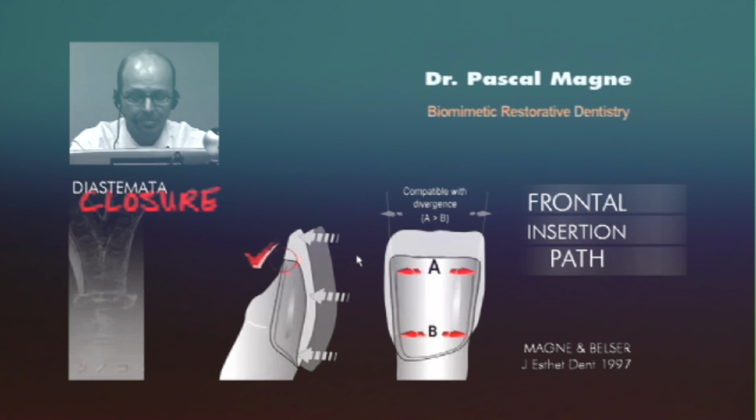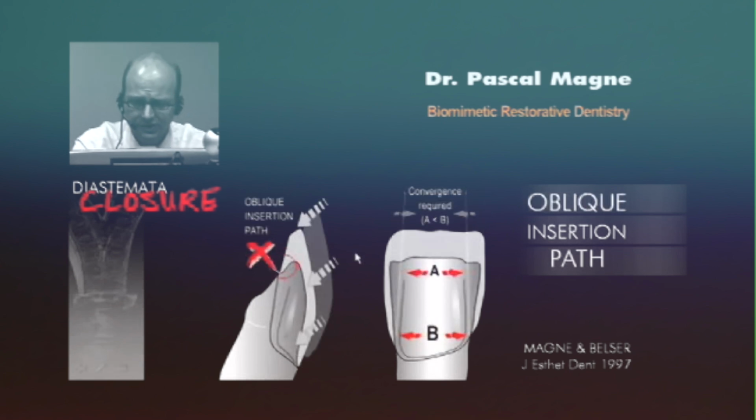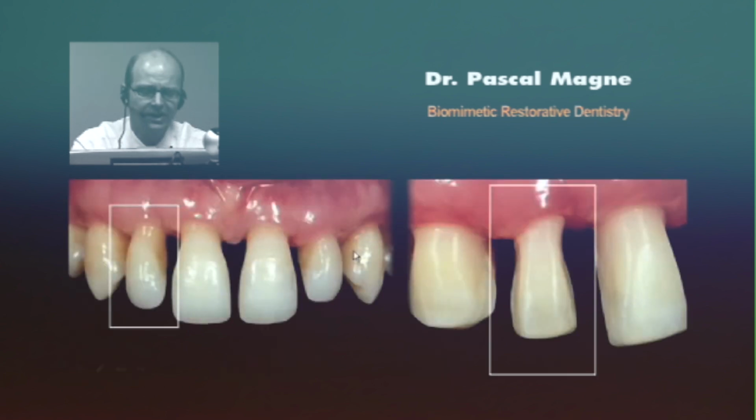And look at this little, very small lateral incisor, and imagine the consequences of a full crown preparation on a tooth like that. And look on the right side, look at the very conservative approach that we could obtain. Most of the preparation here is still in enamel. There's a little bit of dentin exposed at the cervical aspect because it was already exposed before I started preparing, so I could not regenerate enamel.